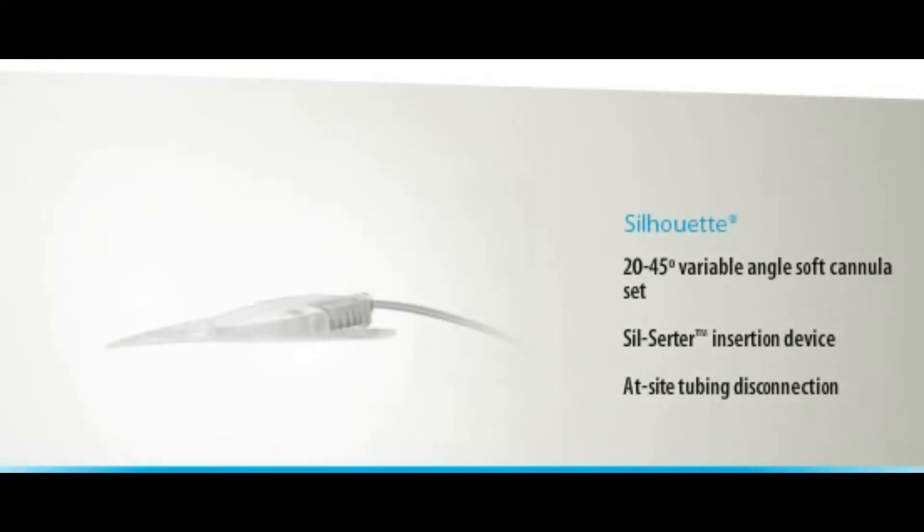The Silhouette offers a soft cannula set inserted at a 20 to 45 degree angle, the Sil-Serter insertion device for controlled insertion depth, and at-site tubing disconnection. The Silhouette may be a good choice for babies, pregnant women, or lean adults and children.